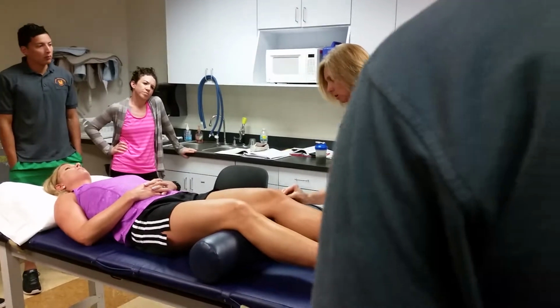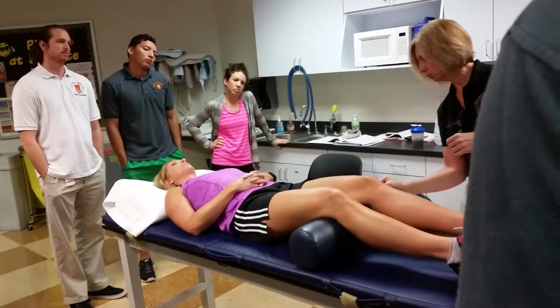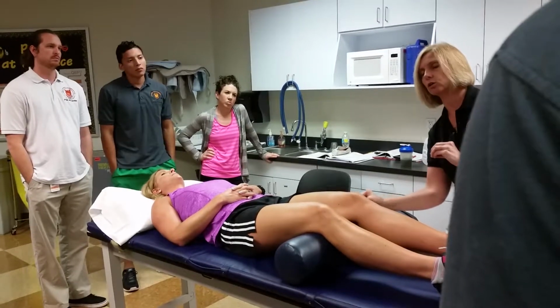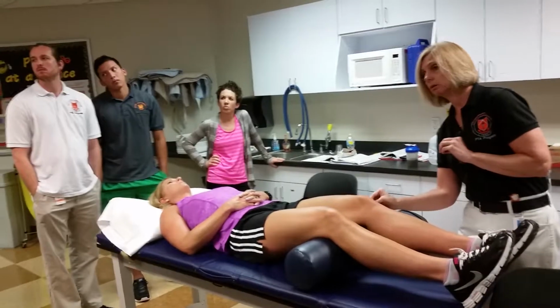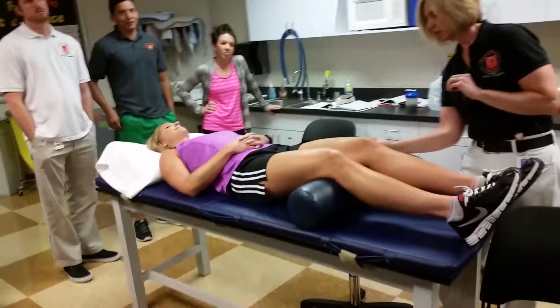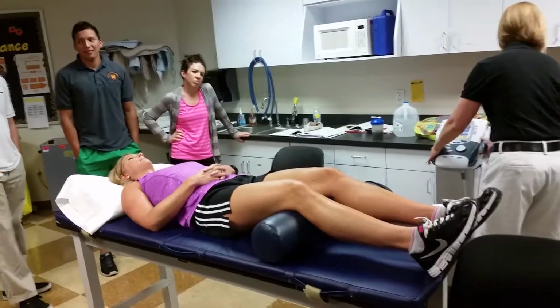So let's say she has iliotibial band syndrome. Anybody know what that is? A tight band that's kind of snapping around the knee, and it creates inflammation and discomfort. So you clean the area that you're going to treat.